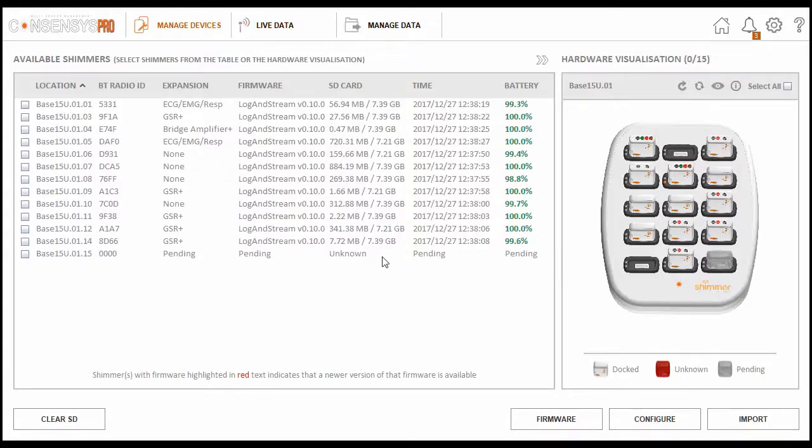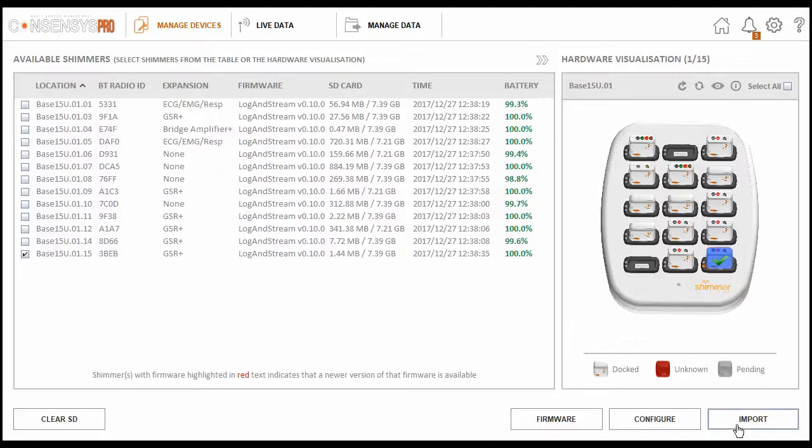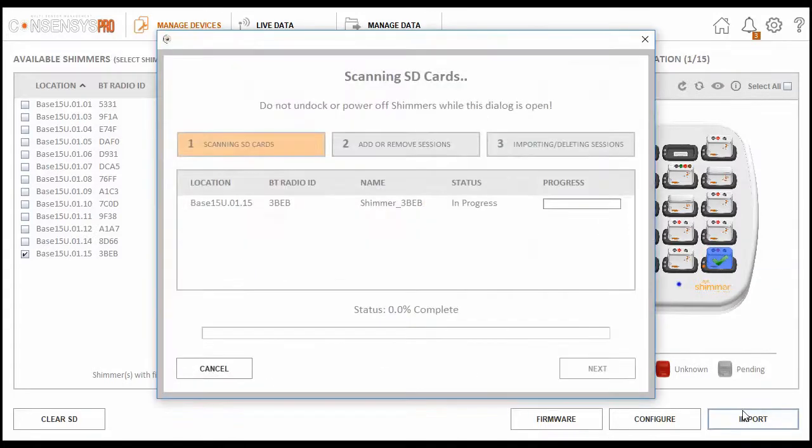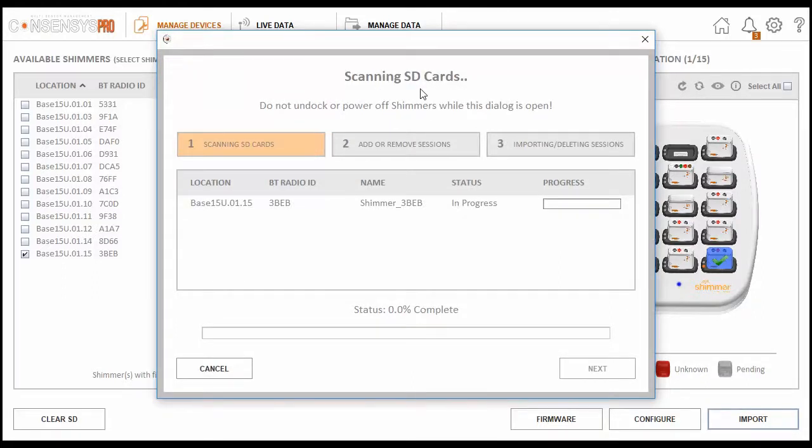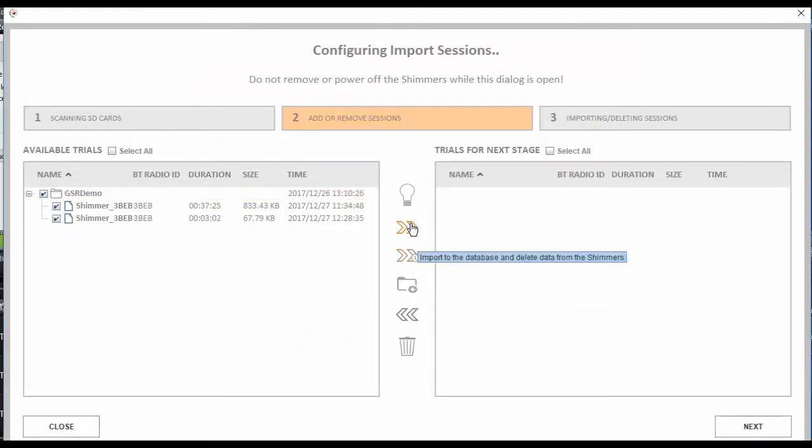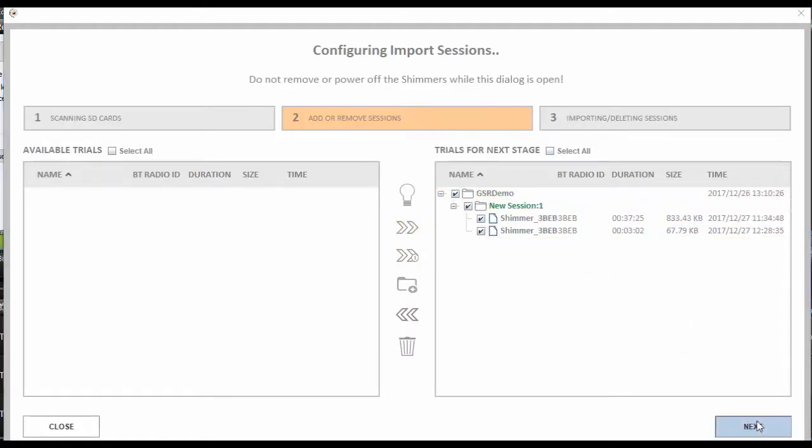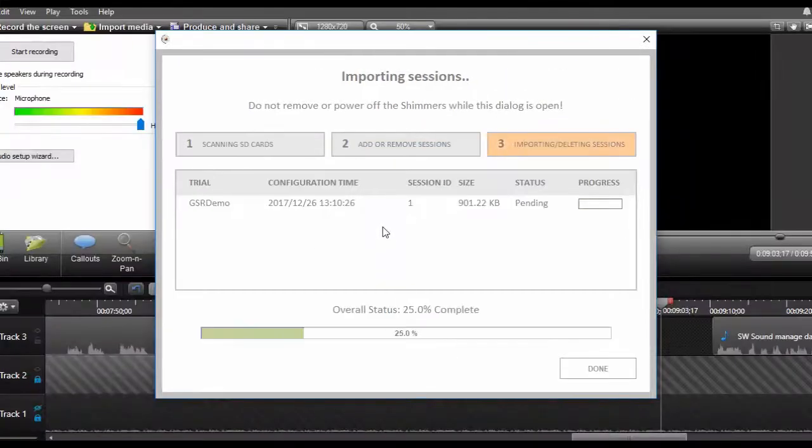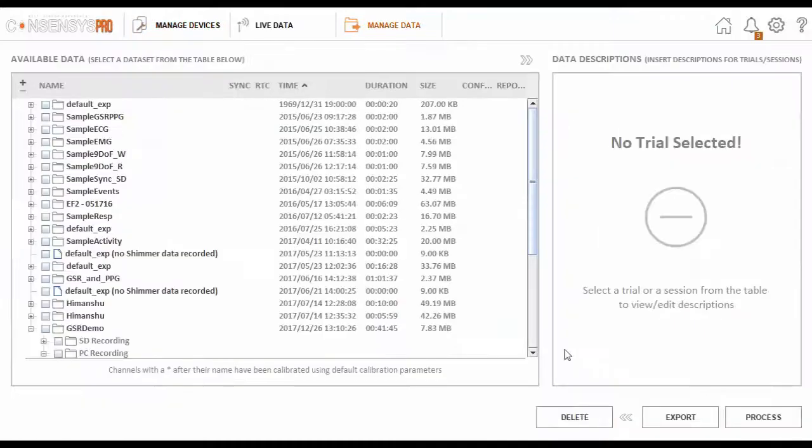The next step is to import the log data from the unit's SD card. I'll now place the unit back in the consensus base. I'll select the unit in question, and select the import button. This process is pretty straightforward and intuitive. The software starts by reading the unit's SD card, and then presents you with the data available to import. On completion, you will see the data is now in the manage data tab.